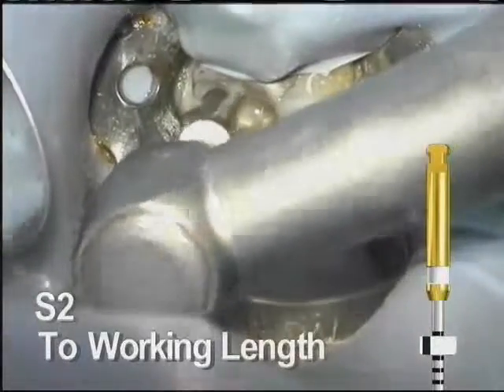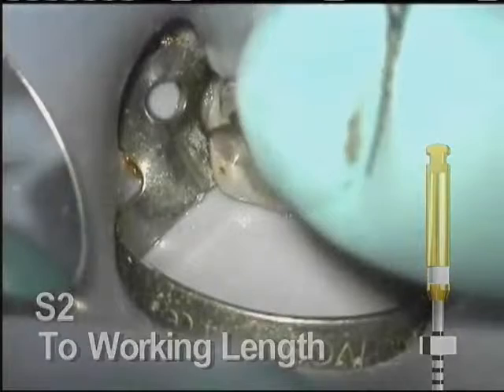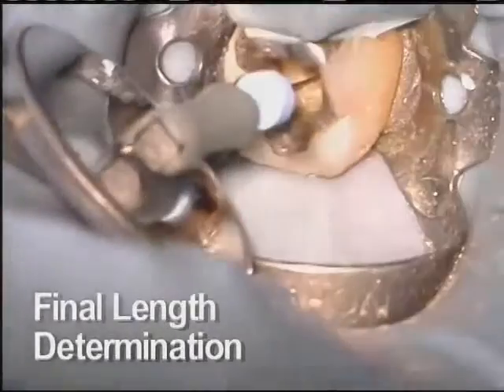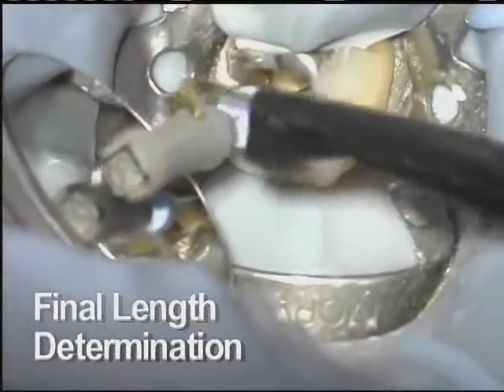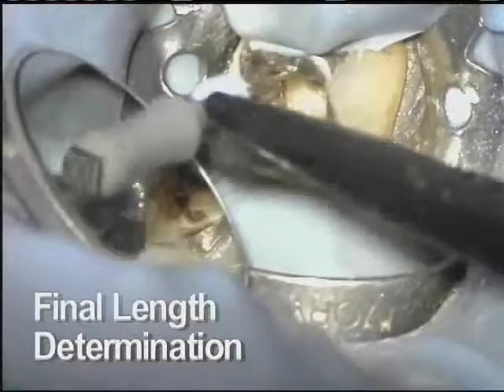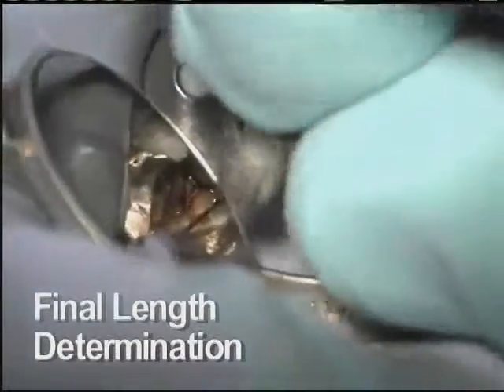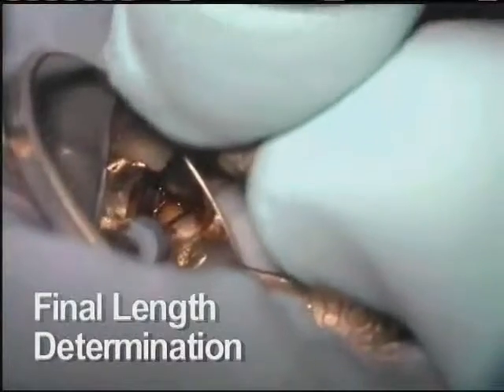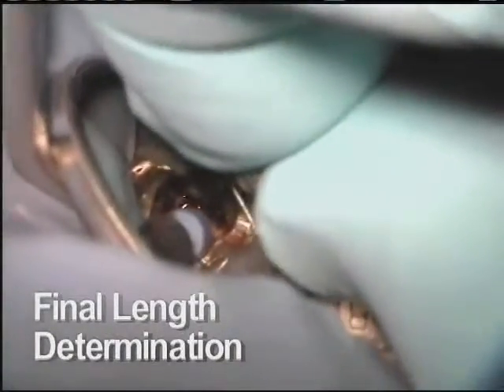Always remove, clean, and inspect every rotary instrument frequently throughout the procedure. Only the final apical size is still to be determined. It is often appropriate to reconfirm length determinations after principal shaping is complete. This is important because removal of obstructions in the canal will actually shorten the distance between the coronal orifice and the apex.